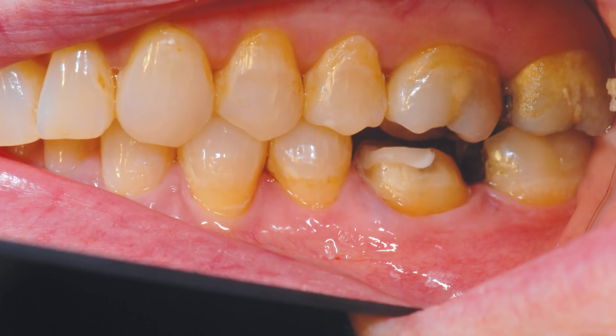Lateral view of the occlusal and buccal reduction performed on the mandibular first molar. The correct preparation for this type of restoration is the same used for a full cast crown, including a non-aggressive design for the margin.